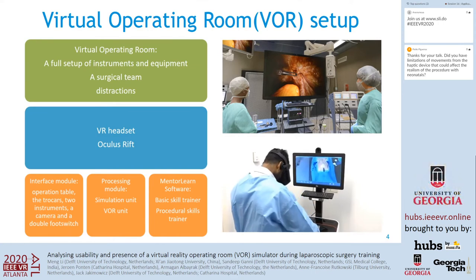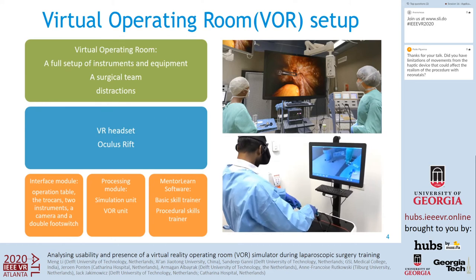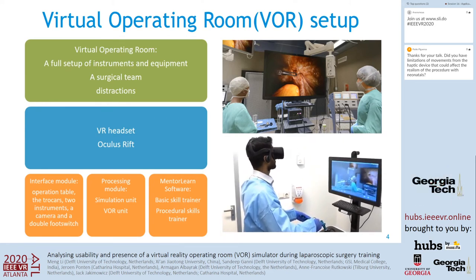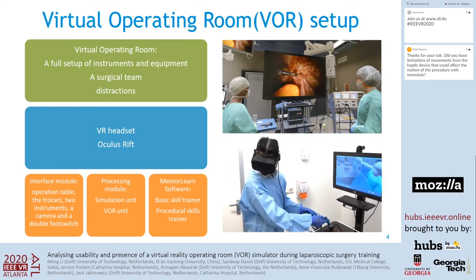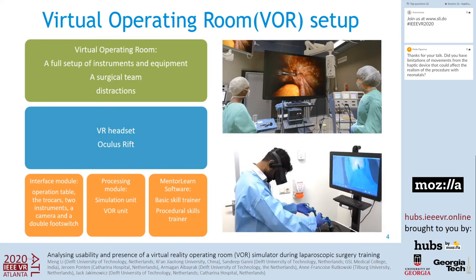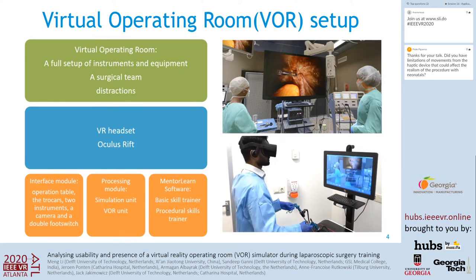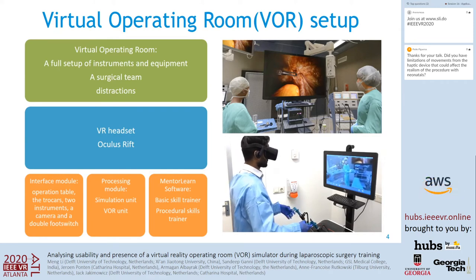I can see my instruments in front of me. And I can see my assisting nurse to my left. I can see my assistant on the right. I can see my anesthetist sitting behind me. Now I'm going to see my pedals in place. I'm going to select my instrument using the tool. And I also get feedback from my nurse confirming the instrument I just selected.